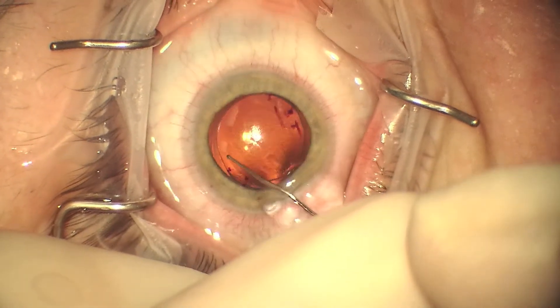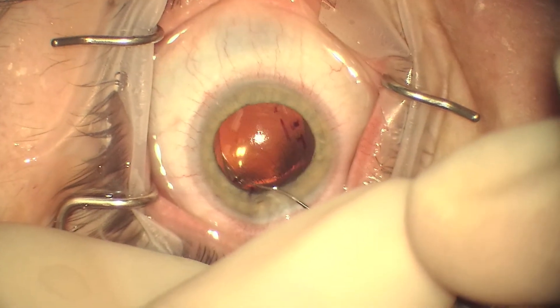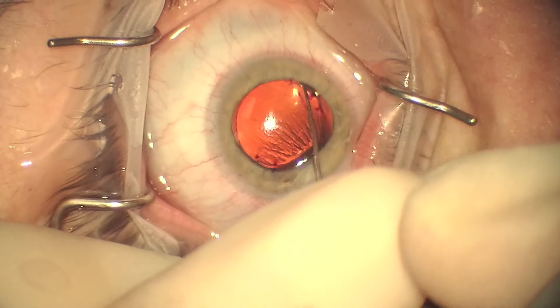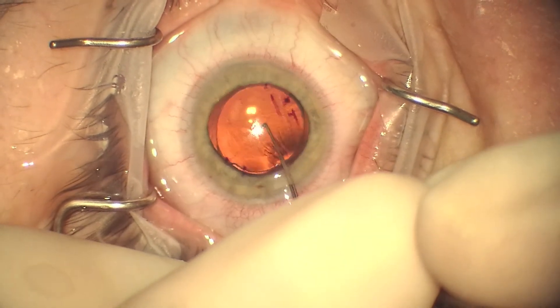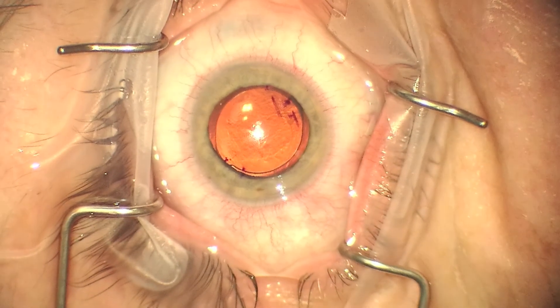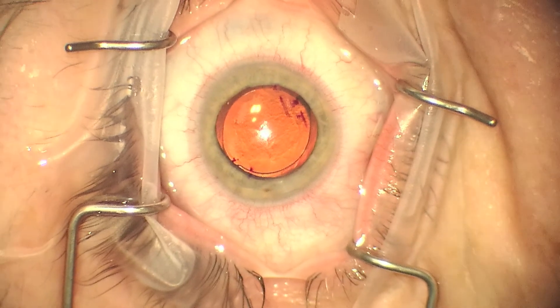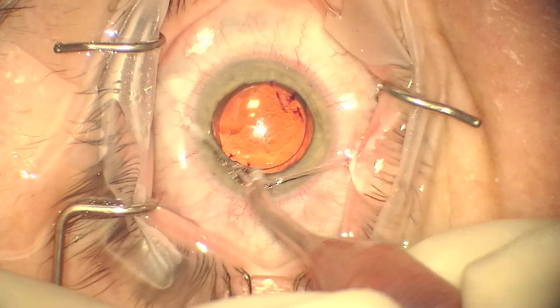Once the haptics are freed from the posterior capsule, the lens can be rotated. This lens has only been in place for approximately a week and a half, so it's quite easy to rotate. I prefer to rotate in the clockwise direction because it's a bit easier, and now you can see that the alignment marks on the IOL are consistent with the ink marks on the cornea and we're in good position.